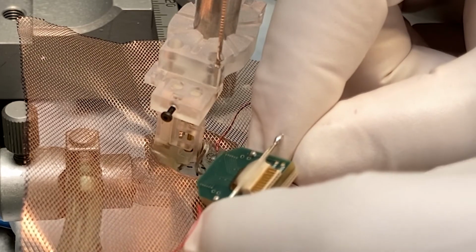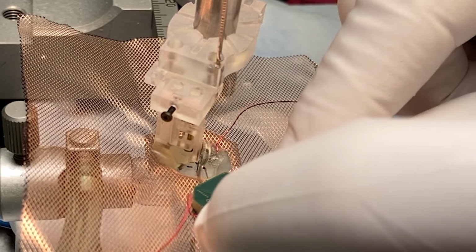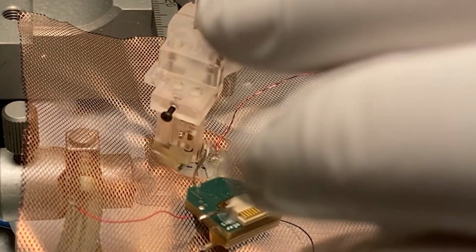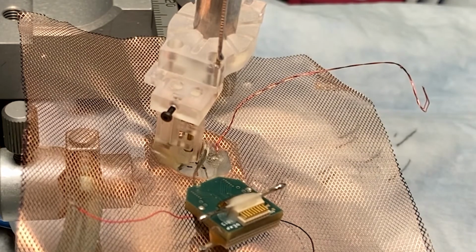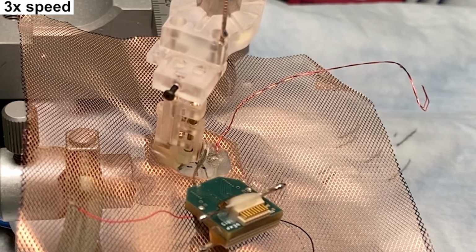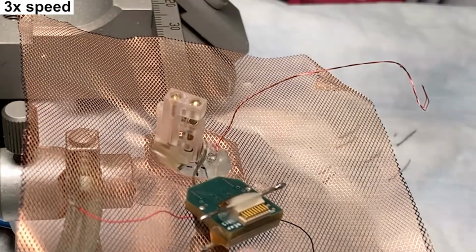It seems scary, but I think it's one of the best and safest options, just to lay the PCB down. And again, be extremely careful not to apply any tension on the flexible cable. Once this is done, you can remove this whole stereotactic arm, and then we can start building the copper mesh around the probe.